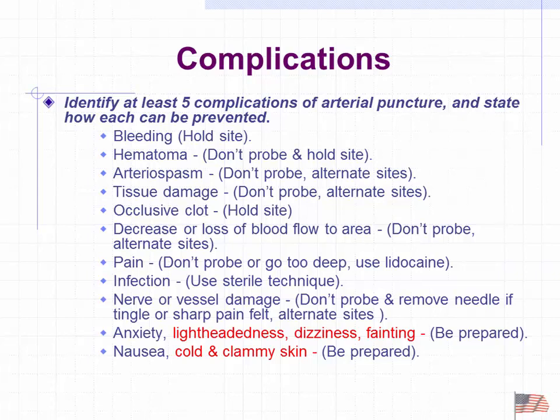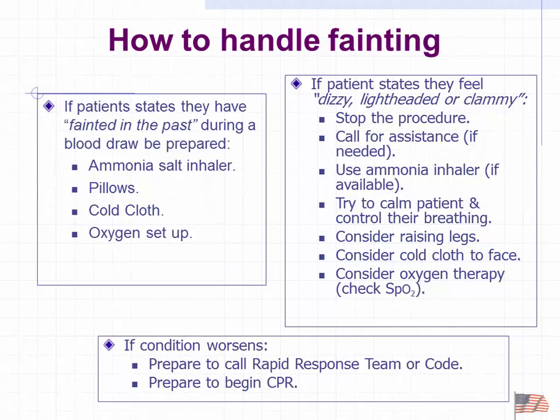nerve or vessel damage. And then there's these ones where you end up having a vasovagal reflex, that you end up having fainting, tingling of the fingers, lightheadedness, nausea. Those are all things where you're best off just stopping the procedure and seeing if we can continue later. And again, those are some of the things we can end up looking at as far as those kinds of procedures. The biggest one there is to try to calm the patient and control their breathing. And if we cannot do anything else, that might be an indication for a rapid response call.